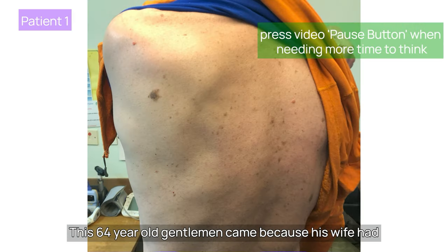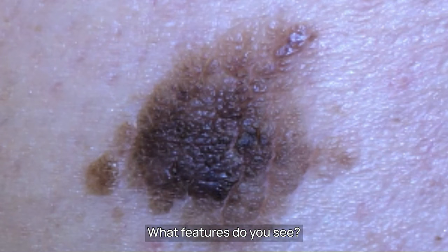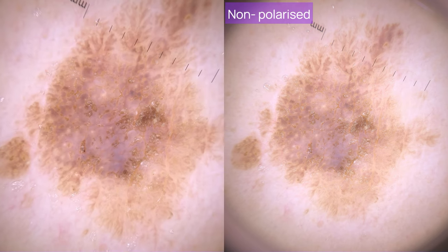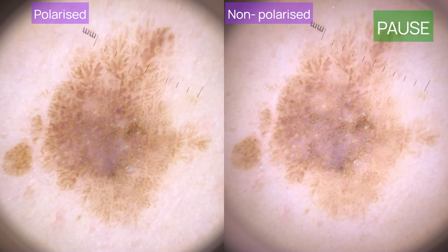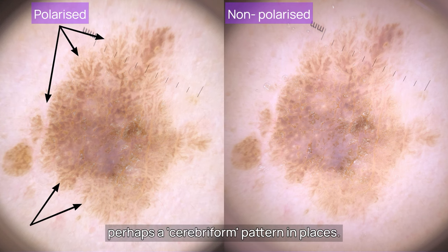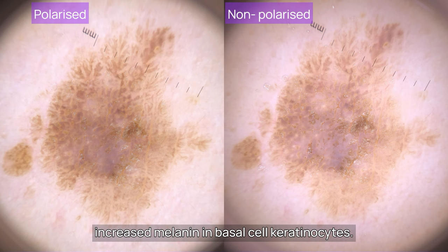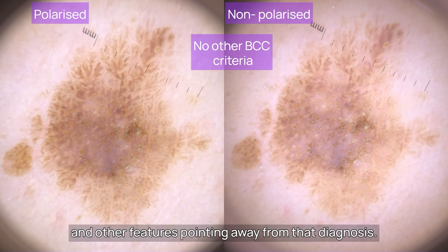This 64 year old gentleman came because his wife had noticed this mole on his left scapula was growing. There's a well-demarcated border, peripheral ridges and fissures giving fat fingers and perhaps a cerebriform pattern in places. A colleague noted they reminded her of leaf-like structures seen in BCCs — and she's right, they are similar. Both are formed by increased melanin in basal cell keratinocytes. However, there are no other criteria for BCC here, and other features point away from that diagnosis.